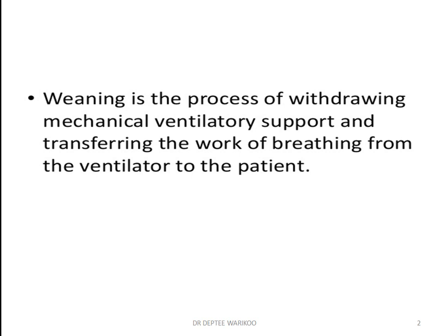For some patients it's very easy, others need a protracted period of weaning with presence of lung disease or after long-term ventilatory support. This period includes a trial of spontaneous breathing through the artificial airway during which the patient is assessed or extubated.